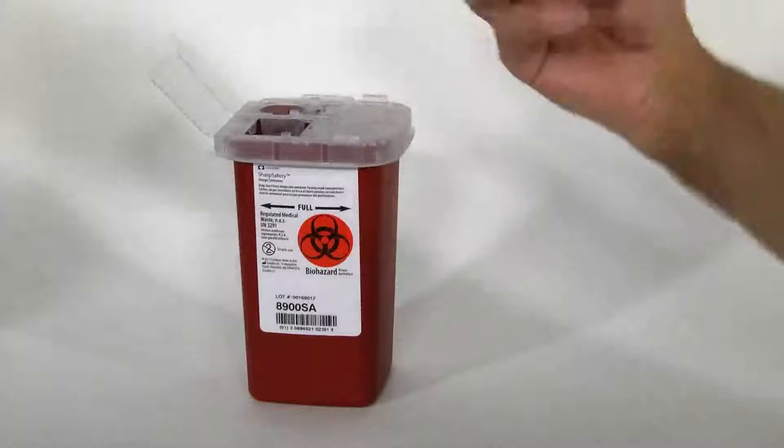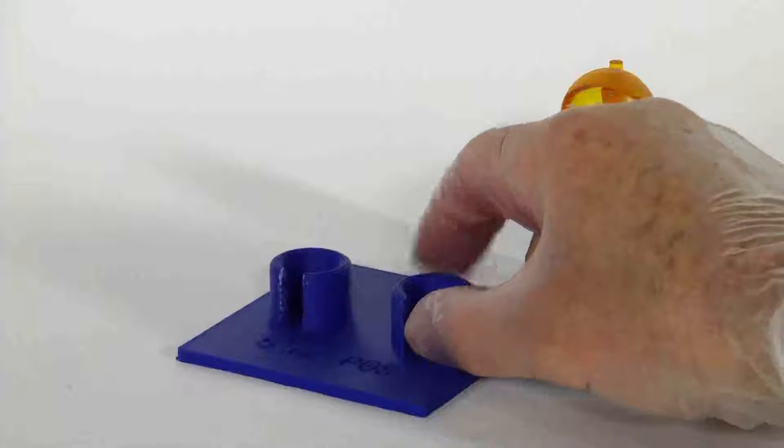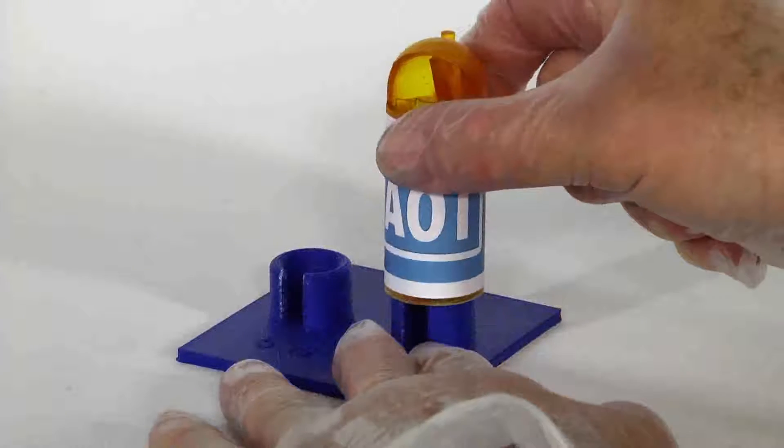Return the base to the bench and install the opener on it. Your AOT opener and base are now ready to use again and again.